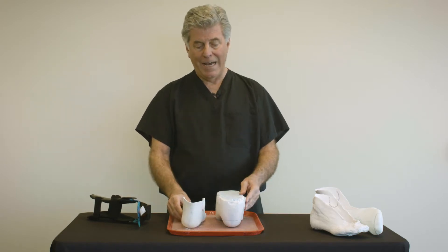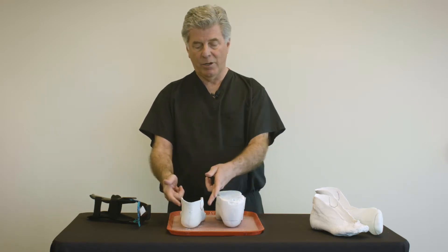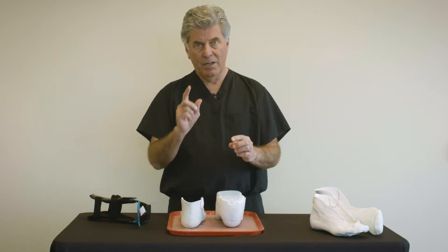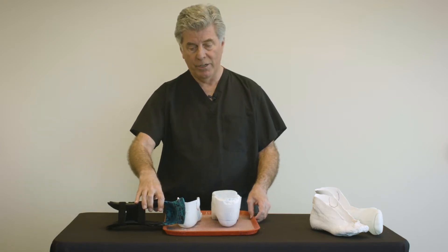The lab will make the width of the malleoli and place the hinge axis exactly where that cast is. But the casting process does have opportunity for error, which I will show you here.